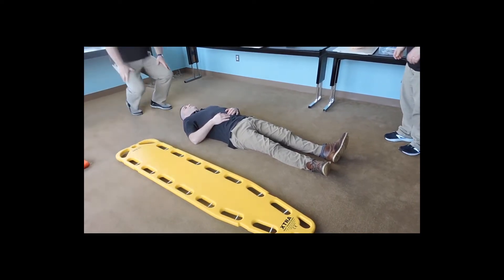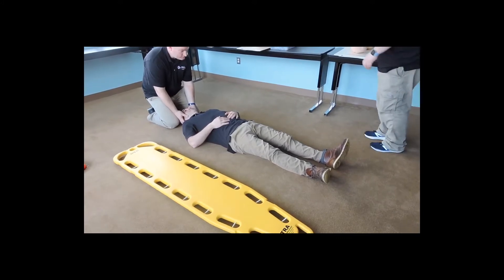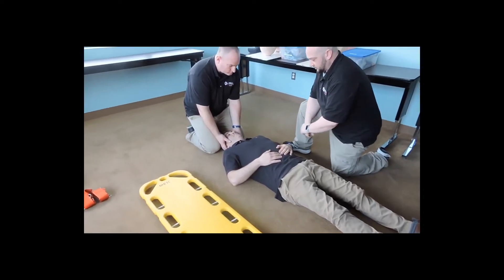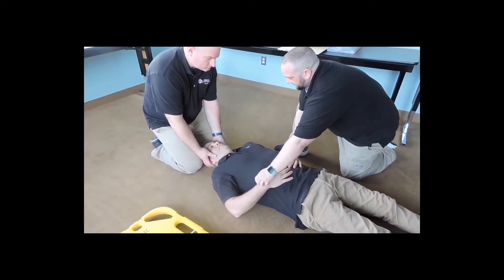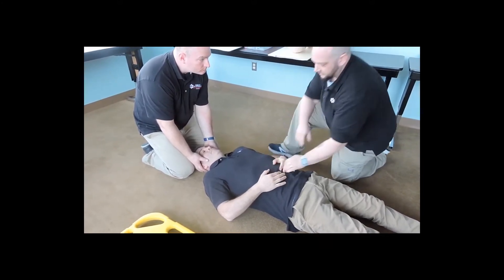I'm going to direct my partner to come in and take in-line immobilization with C-spine. I'm going to approach my patient. Sir, how are you doing today? My name's Joe with the ambulance company. Are you okay if I check you out? I'm going to check for radial pulses, making sure they're present and equal on both sides. Can you feel me touching you? And the same on both sides? Can you squeeze my hands? Good, equal grip strength.